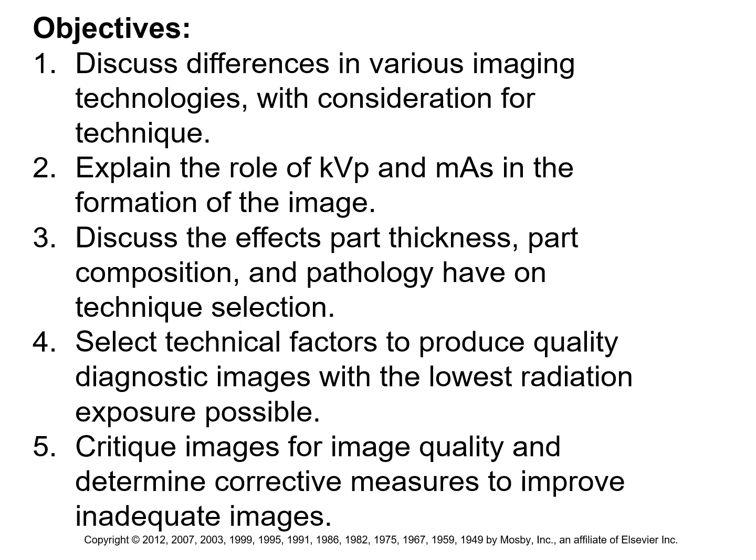Okay, pathology. Is it a tumor? Because tumors are usually more dense than the equivalent healthy tissue. So in effect, thickness is not really thickness, but tissue composition. The tissue density is increasing with tumors being present. Okay? Does the patient have pneumonia?